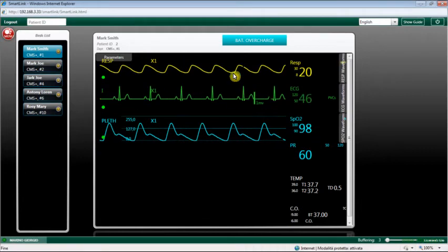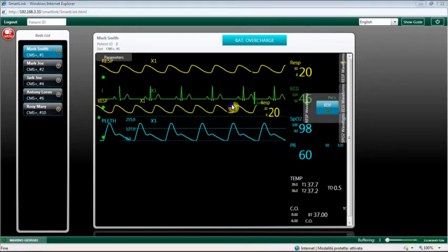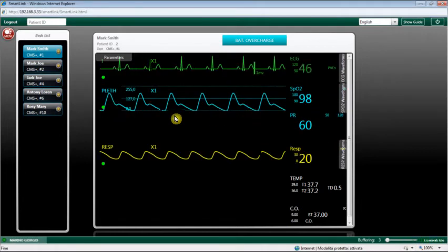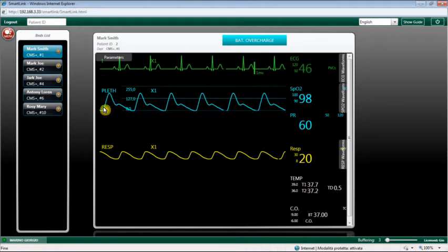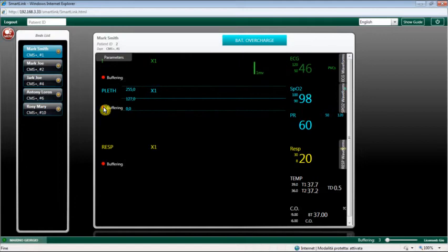Click the freeze button to stop and freeze the waveform. Click again on the same button to restart.